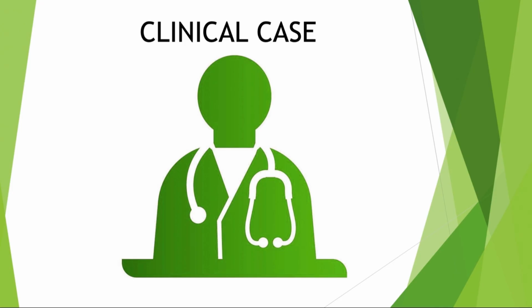So we're going to talk about a 55-year-old woman who comes in for a consultation because of chronic abdominal pain that's been going on for several months. Abdominal pain that's mostly triggered by meals, mainly occurring after eating.